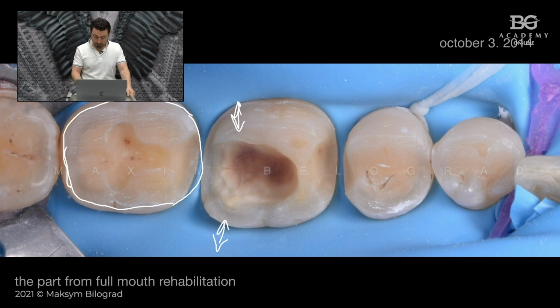Lower 5, it is the same as lower 7. Basically, it is tabletop. Why tabletop? Because of the occlusal rehabilitation and also extension to the vestibular part because of the aesthetics. In this case, we are changing the color of the patient's teeth, so we have to go with vestibular preparation. Same for the lower first molar.